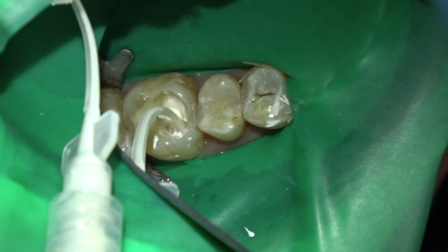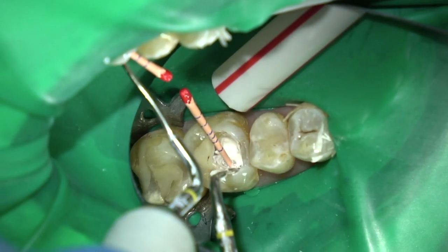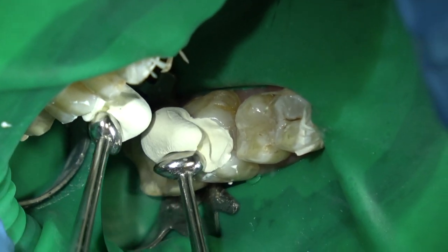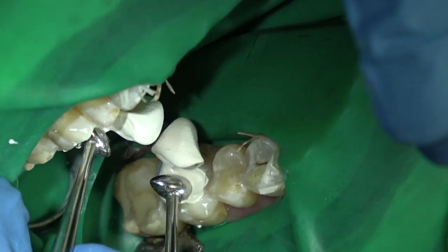Then here's the third canal under a little bit of pressure. The heating element, seared it off, plugger. I'm going to fill this with IRM. This is just a very easy way to place a buildup. Once it's set up, you're not going to have any trouble with eugenol in the IRM affecting either composite or crown and bridge cement.